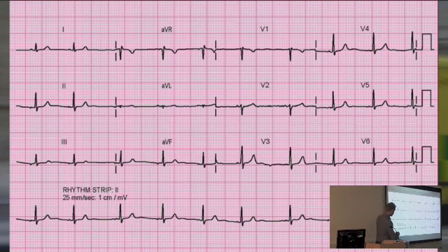We are going to say it's a standard 12-lead ECG. We've got a lead 2 rhythm strip at the bottom here. It's appropriately calibrated. We've got a calibration curve on the far side there, and it's 25 millimetres per second. That's the type of ECG.